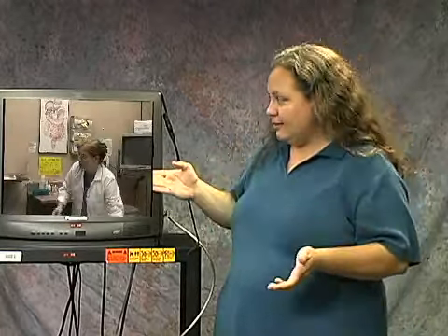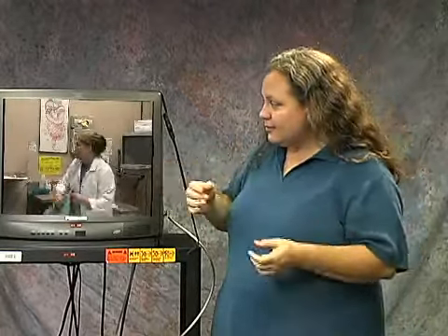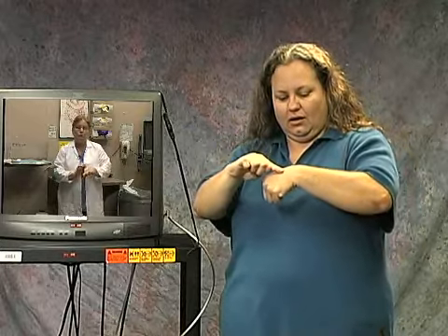When you come in for this exam, you'll come into a room that looks like this. Your nurse will have you lie down on the bed. You will be hooked up to some monitoring equipment, a blood pressure cuff, because you're going to receive what's called conscious sedation during this exam. Conscious sedation is not putting you to sleep. We'll insert a small catheter into your vein, which will be the avenue the doctor uses to give you sedation.